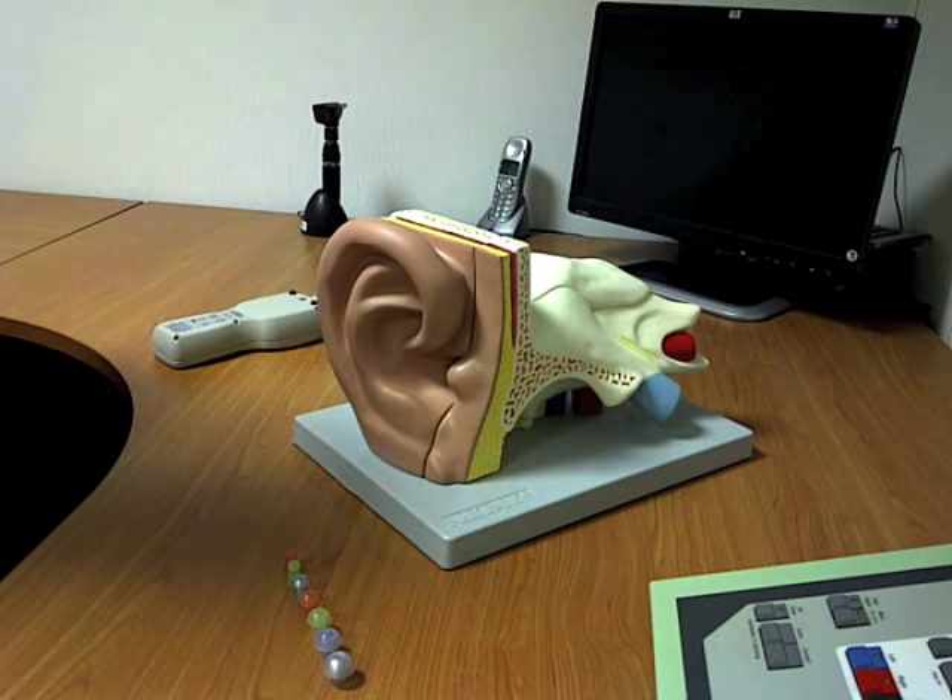One of the tests that audiologists working with Ascent Hearing Care often carry out is what's called tympanometry — a measure of how efficiently the conductive part of the ear works. It's a purely objective test; you don't actually have to do anything at all, just sit still and quiet, and the test takes a couple of minutes.